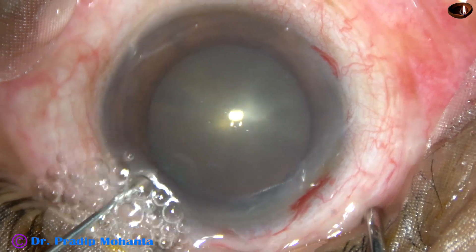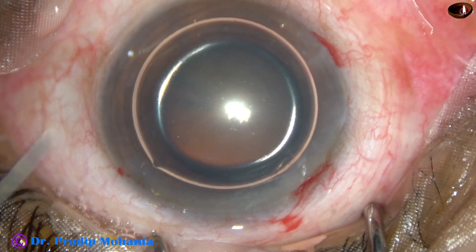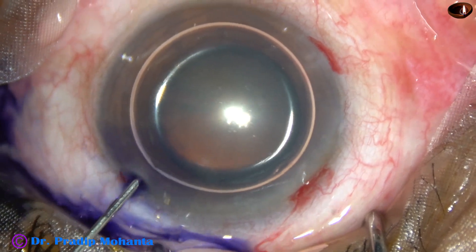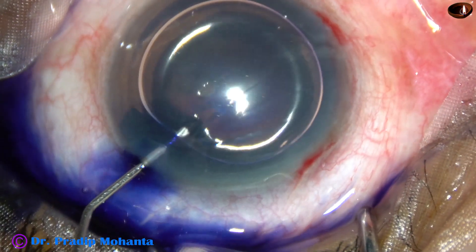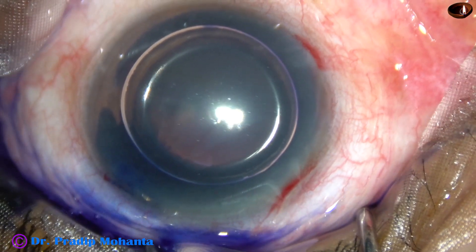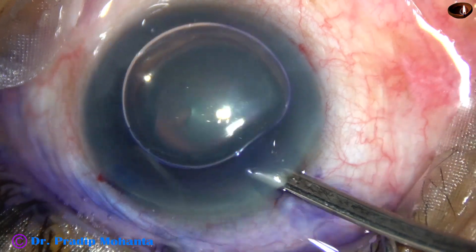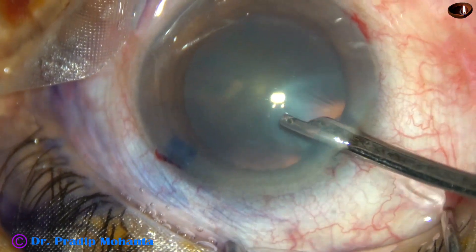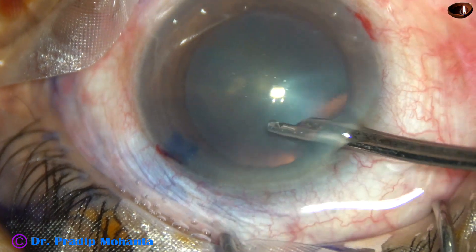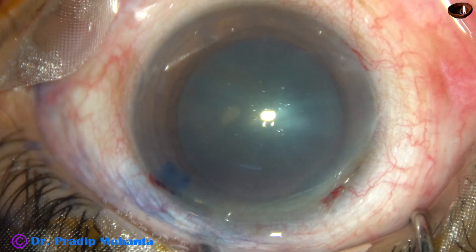An air bubble is injected into the anterior chamber, and then trypan blue dye is applied underneath this air bubble. When you apply trypan blue beneath an air bubble, staining is very quick — within 5 to 10 seconds, a good staining occurs. This is real time. The dye is washed out, and note the anterior capsule has been very nicely stained.